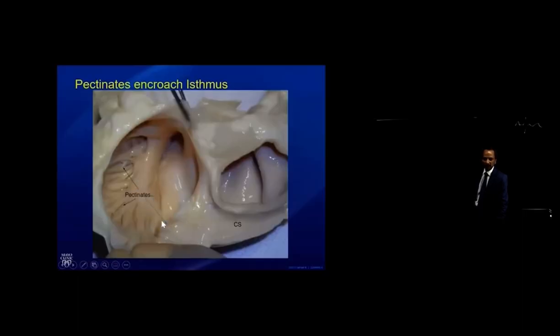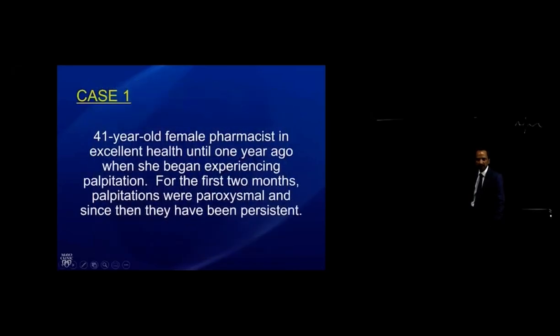Should also be aware of thickness of the tissue in that region. Does it vary? If so, the same type of ablation going from one to another will be difficult to do. And if there are crevices and we get our catheter trapped between those two crevices, it may be difficult with thermal energy to be able to give an effective lesion. And we can look at specific examples of this as well.